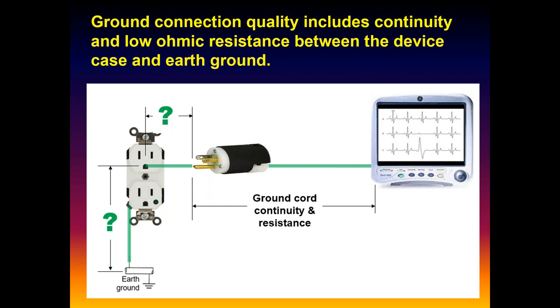What we haven't done, and I think we just tend to think, well, that's a facilities issue, is we never really give a lot of thought to what is the ohmic resistance between the pin and the socket of the outlet. If you ever had a sloppy outlet, especially in our homes, where the receptacle is not grabbing the plug very well, you can get some high resistances in there. In fact, if it becomes too high, that's precisely what will make the plug warm. If you ever notice that, with a toaster or a microwave or something that has high current demand, you feel a warm plug, there's a good chance you have power being dissipated between the sockets and the pin. And again, I squared R.